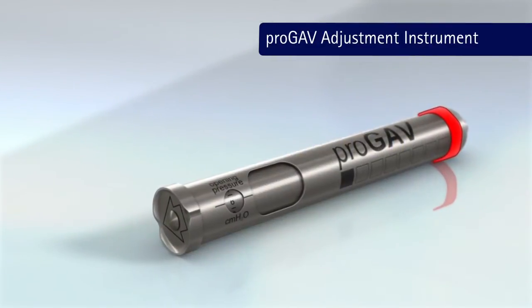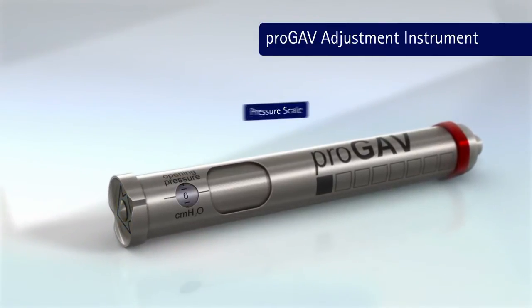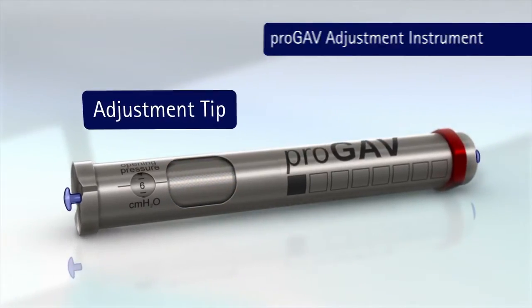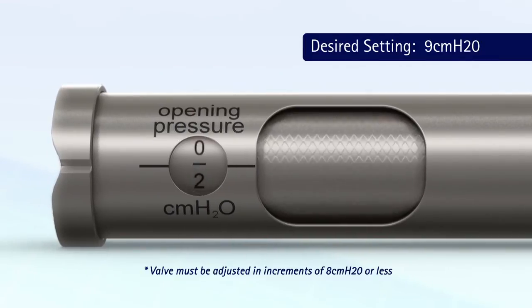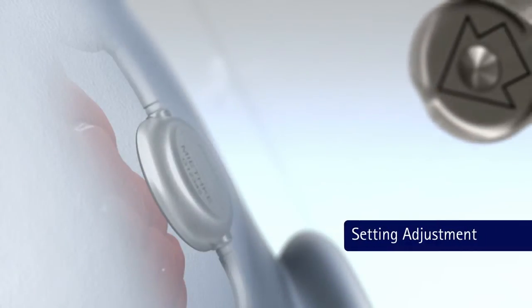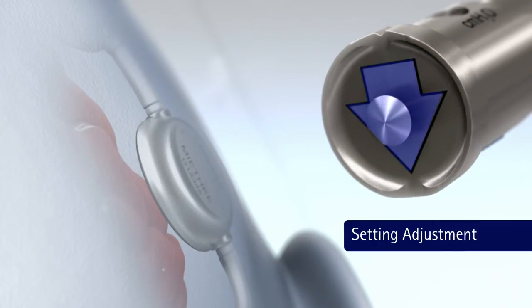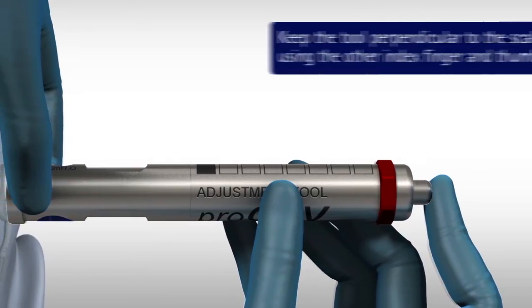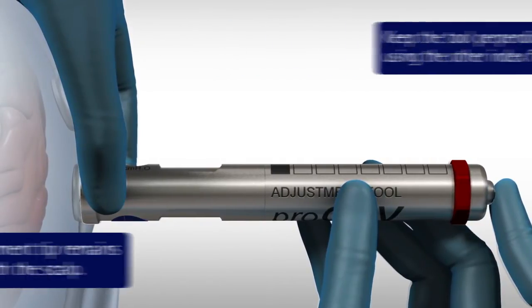The current setting of the valve can be changed using the adjustment tool. Rotate the adjustment dial to the desired setting, with the arrow pointing in the direction of CSF flow. Depress and release the button slowly, ensuring the adjustment tip remains in contact with the scalp.